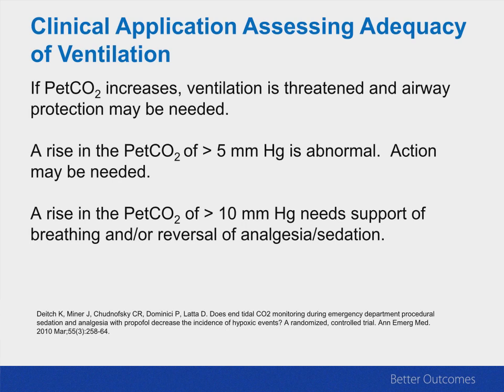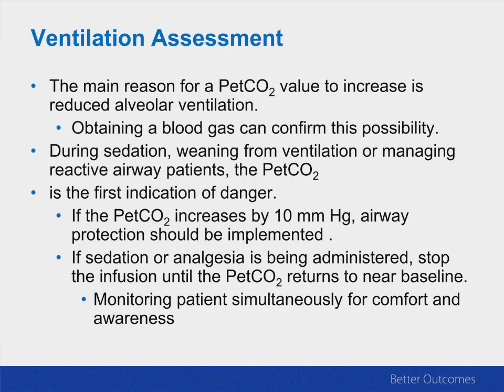If it goes up by 10, you really need to be considering supporting the patient's breathing. Or if you've given them sedation, you might have given them too much. Because the normal drive to breathe is so strong that a slight increase in the carbon dioxide level would trigger breathing to reduce it back to normal. So if I see a patient who is not reducing their carbon dioxide level back to normal, then we know that something's wrong. And really, this concept is at the heart of using capnography to monitor patients in terms of understanding, is this person getting adequate breathing or not?